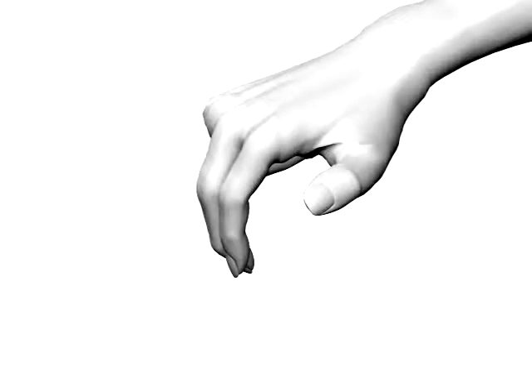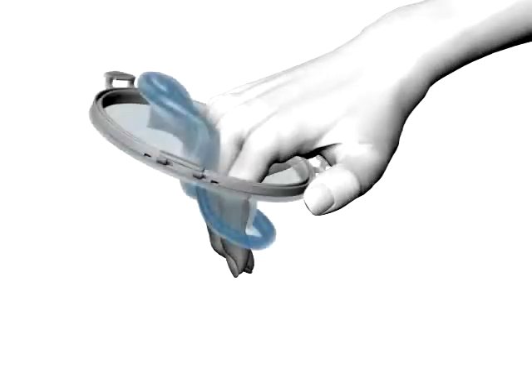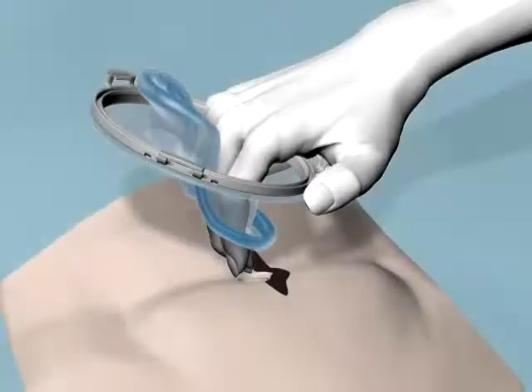Installation and assembly. Insert the index and middle fingers of your dominant hand through the retractor's center aperture with the inverted portion of the retractor ring on the opposing side.